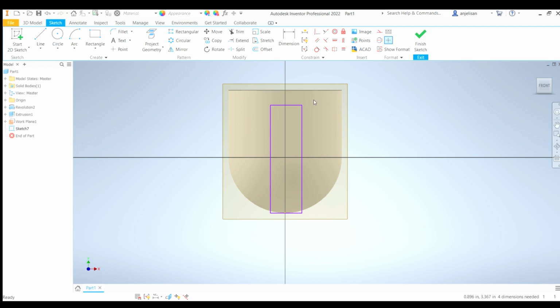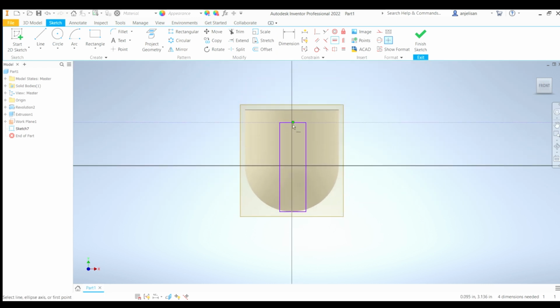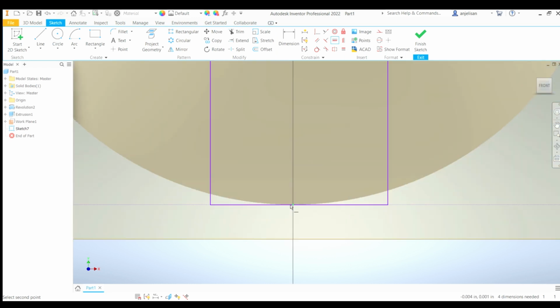Now we're gonna go over probably two constraints in this tutorial. One of them is the horizontal constraint. We want to make sure that this is centered, horizontally aligned with the center of the bottom of the cup. That makes sense. So again, horizontal constraint, and then click on this.